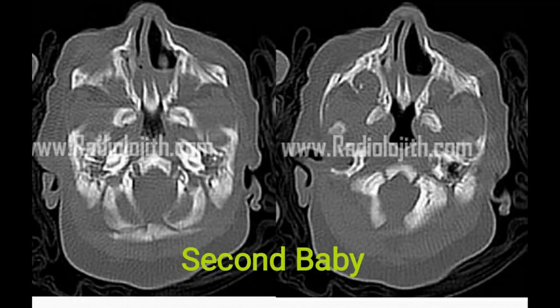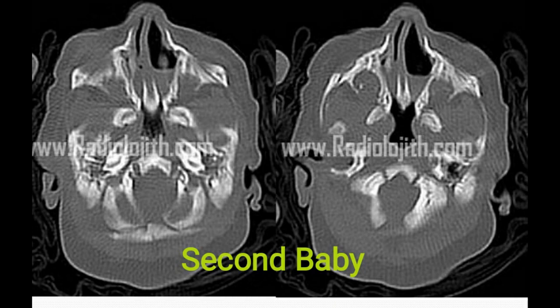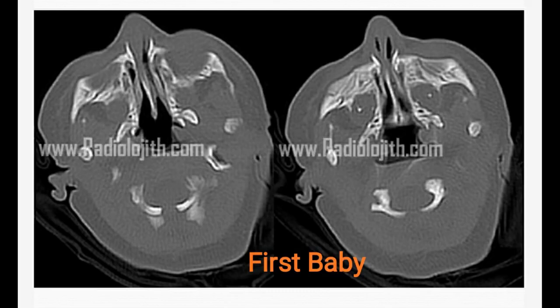I have already given the hint of CT PNS, and both of them had normal antenatal scans done periodically, and both of them delivered pervaginally with near normal Apgar score in 1 and 5 minutes. Please see the images again and give the findings and the diagnosis. Remember that the symptoms are the same, but the CT findings and the diagnosis are different. If you want more time, please pause the images and then proceed.